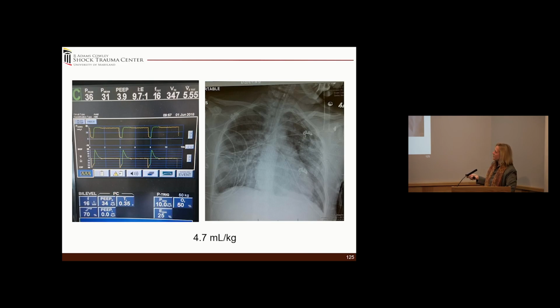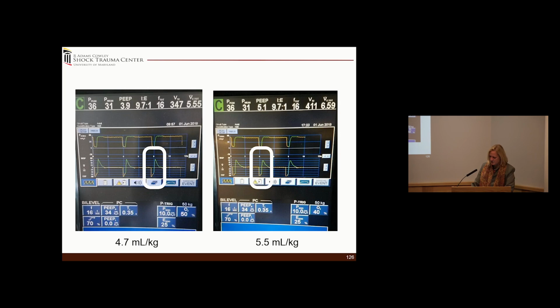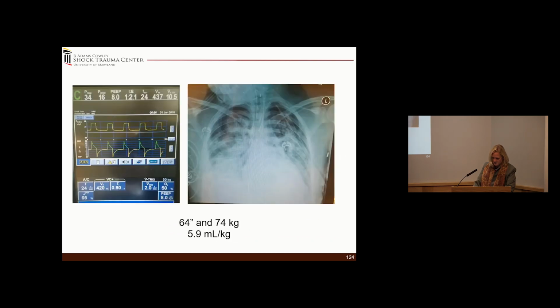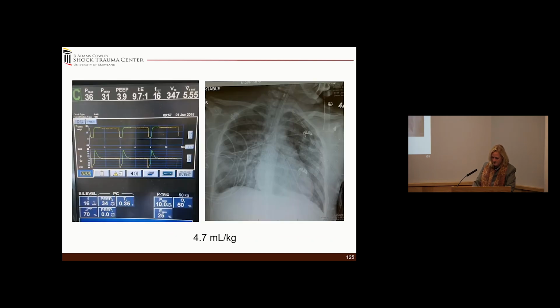So I switch over to TCAV. So that is my T low. So I have 34 over 0. Actually, my rate is only 16, and my T low is 0.35. And was it 16 before? Yes, it was 16. Sorry. My T low is... I actually came down on the rate, and my tidal volumes are down to 4.7 mLs per kg.